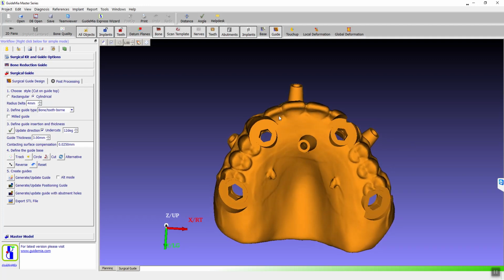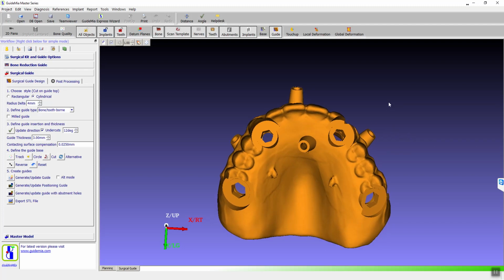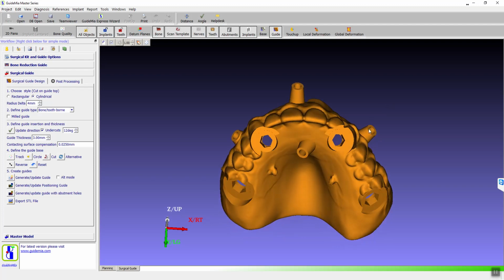Yeah, you have those denture teeth. I'm just talking about position, aligning it via surgery. There's enough teeth there.